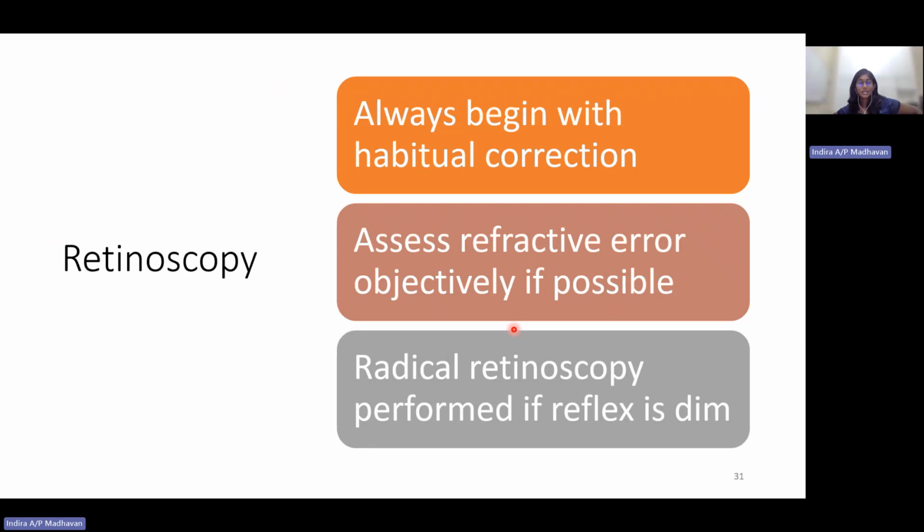If you are able to see the reflex at 20 centimeters, you perform the retinoscopy at 20 centimeters until the reflex is neutralized.